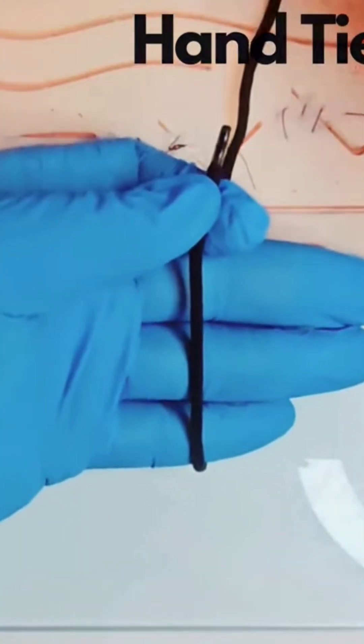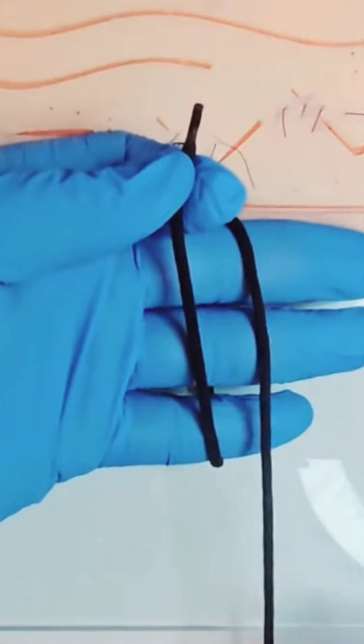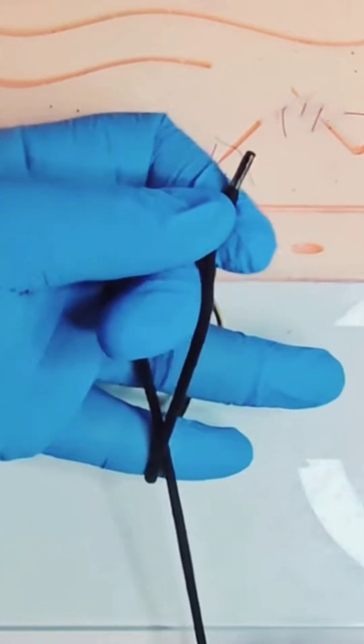Using your right hand, run the long thread down your palm parallel to the short thread. Flex your middle finger over the long thread and push the short thread under it.